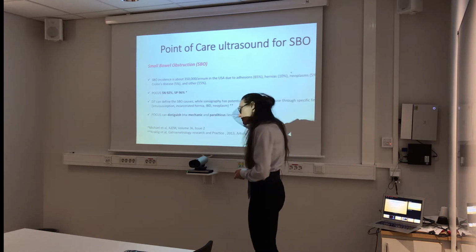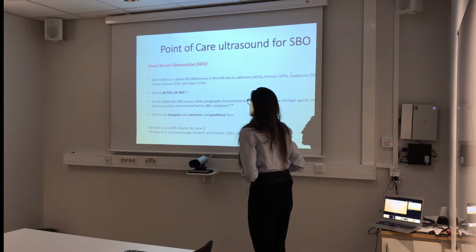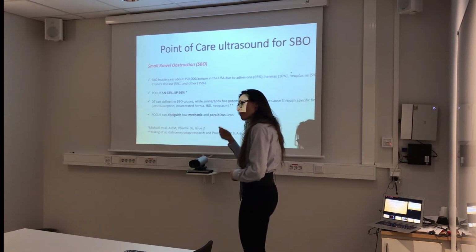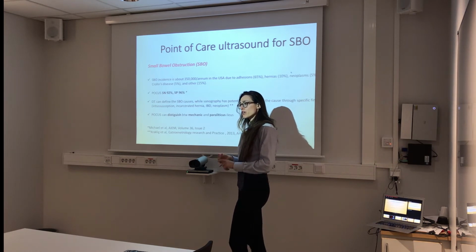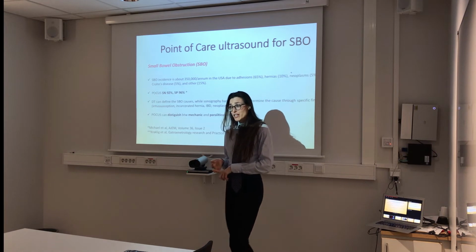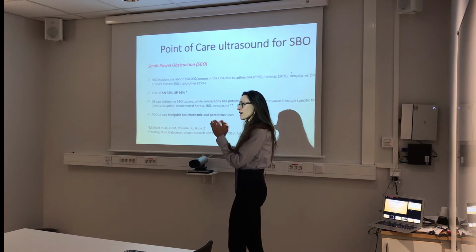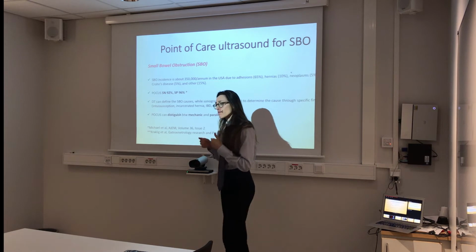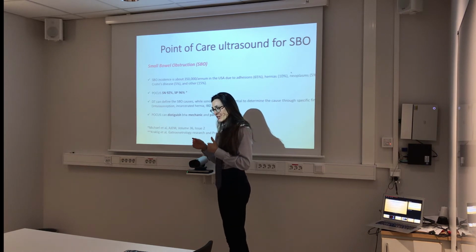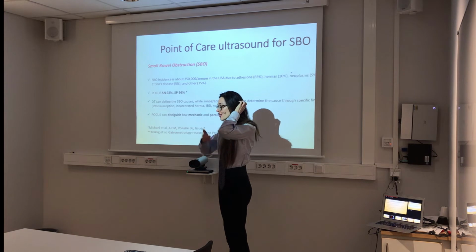For small bowel obstruction, this is an American review of the American literature, they say there are a lot of cases, but the problem is now they're growing because people have a lot of surgery and because people have a lot of relapsing small bowel obstruction. This is actually the kind of people, the ones that have many episodes. That could be our target in terms of, will I change the plan because I see the small bowel obstruction with the ultrasound?